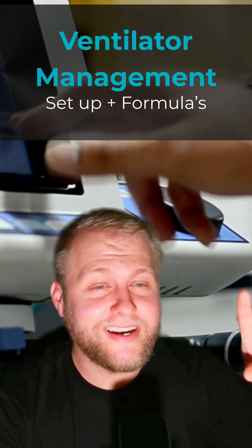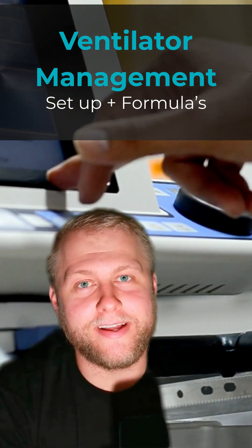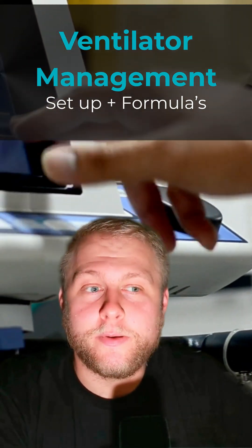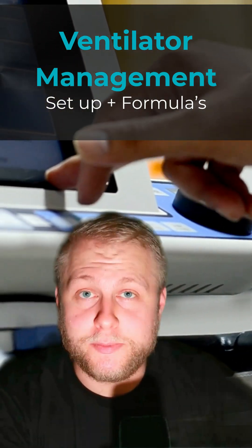So we just intubated your patient, your arms getting tired from bagging, we got to put them on a vent. For this scenario, let's use a perfectly normal patient who's just intubated for airway protection — they don't need any special respiratory settings.